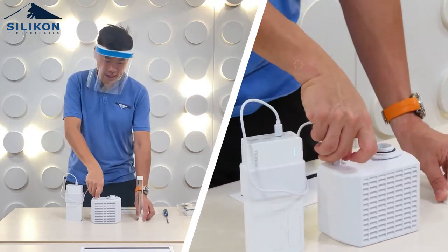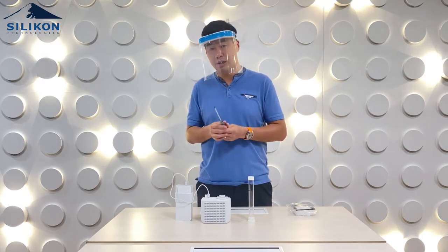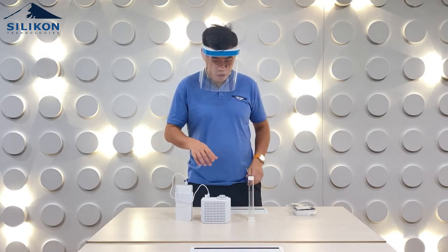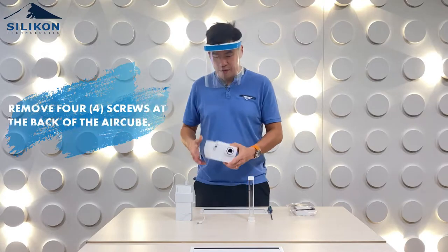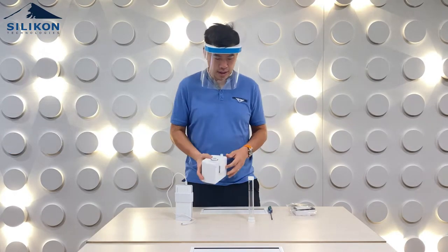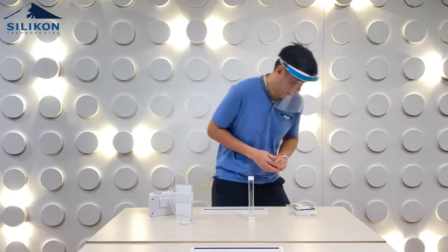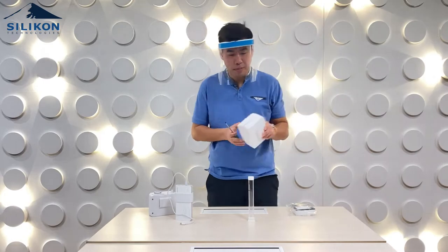Now let's assume you need to replace the HEPA filter. All you need is a Phillips screwdriver, and there are four screws that you have to remove at the back of your air cube. You basically just unscrew them.